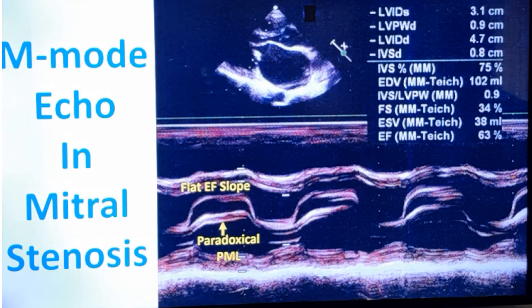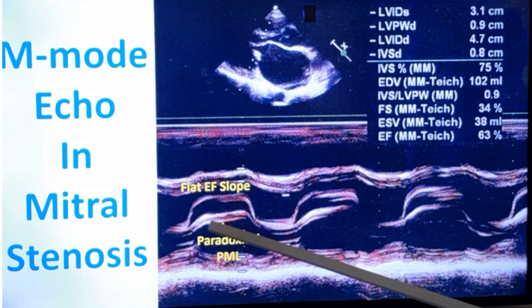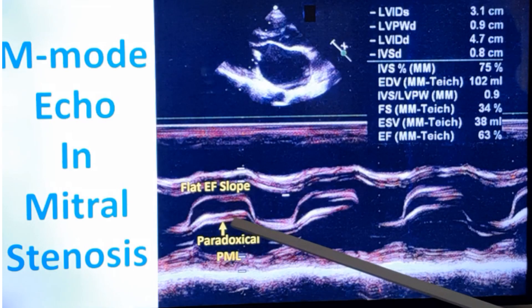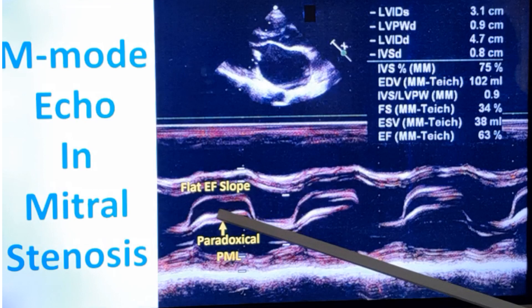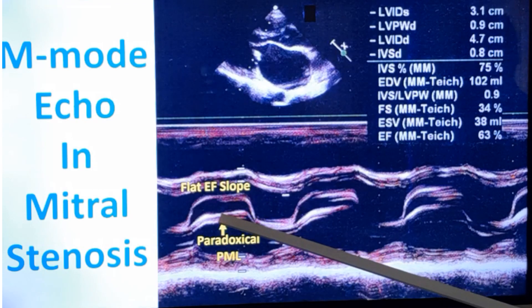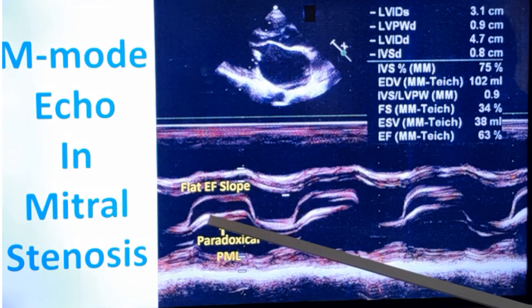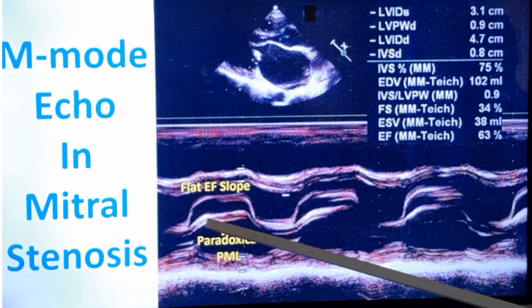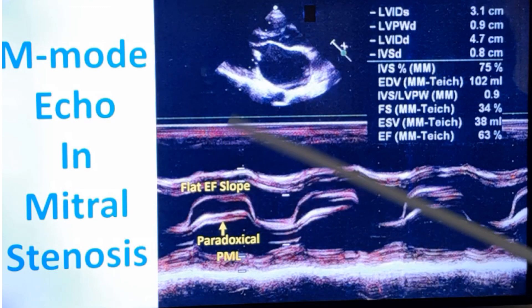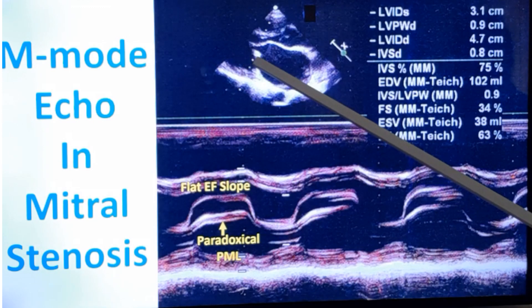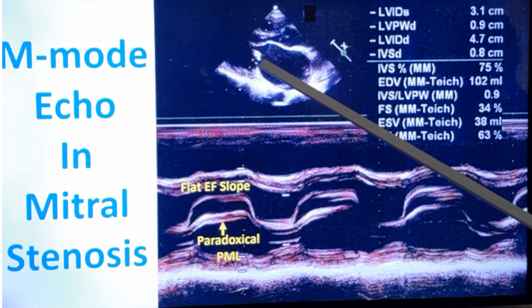The second important feature is the paradoxical movement of the posterior leaflet. The density is increased, indicating fibrosis and calcification, which is very well seen in the 2D image as well.